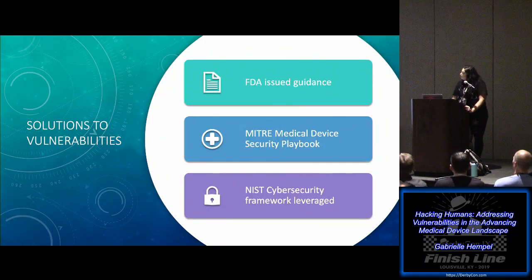So what are our solutions to these vulnerabilities? The FDA has issued guidance, both pre- and post-market, to offer recommendations for management of medical device security risks. MITRE unveiled a medical device security playbook in October 2018. This enables healthcare organizations to plan for and respond to incidents and develop a preparedness and response framework.